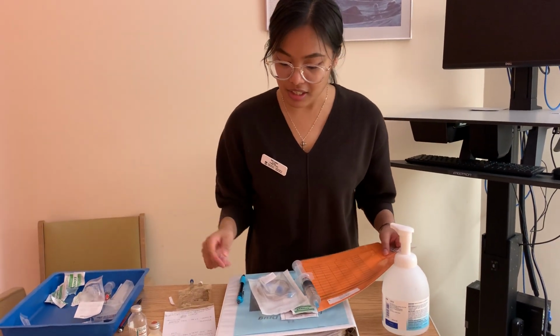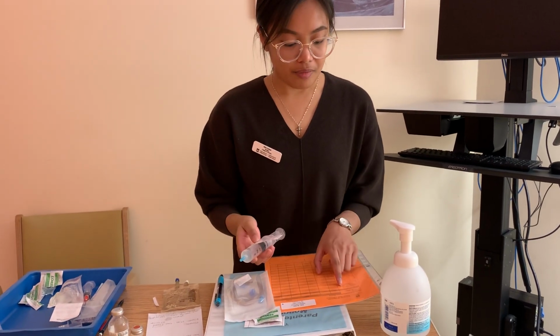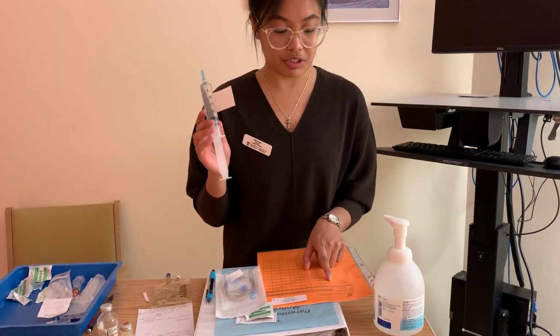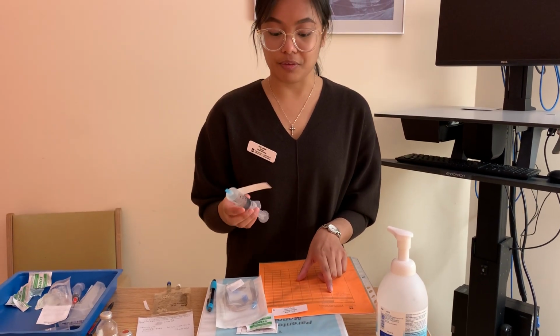We already got the verification from the patient. So I have here comparing my medication syringe. Right patient, the patient verified Erica. Right medication Penicillin G. Right dosage is 2.5 million units, which we have in here. Right route is IV. We have the syringe and the CIVA pump is working, and the right time frequency is every 6 hours. So we're going to give it now.